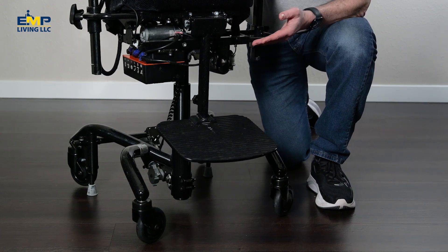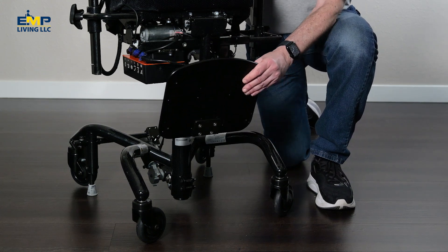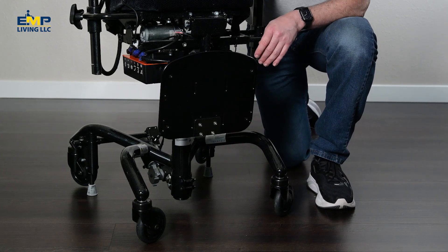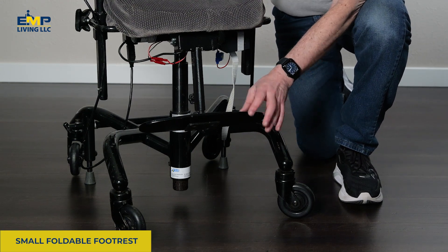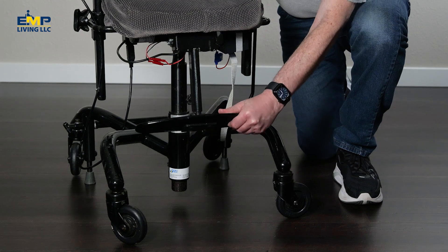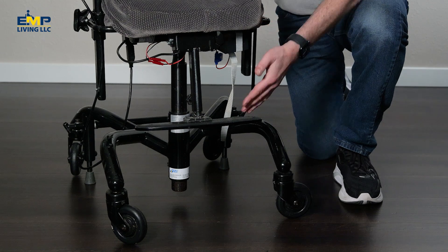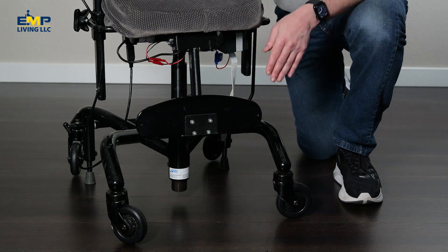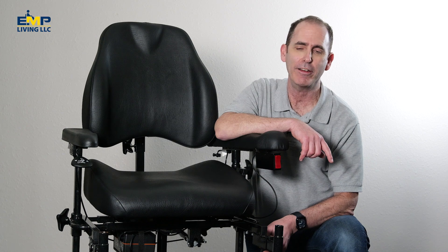This foot rest is often chosen by kids. One thing to note with the foot rest is that if you want to try to walk the chair while you're sitting, the foot rest itself will get in the way and your feet will hit it. Another foot rest option we offer is the small foldable foot rest — it's similar to our large one except it's much thinner. It folds up if you need to get it out of the way, and it also moves up and down with the seat cushion so it's always at the right height. Like the full foot rest, it's not removable, so if you try to walk the chair while sitting your feet will hit the foot rest.